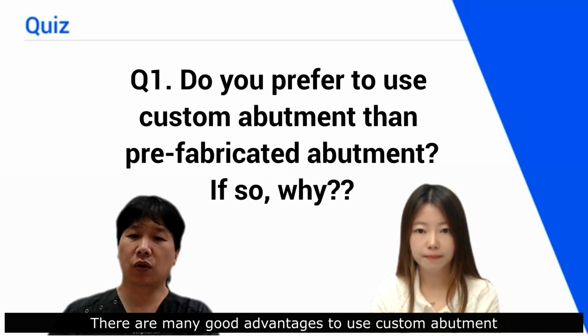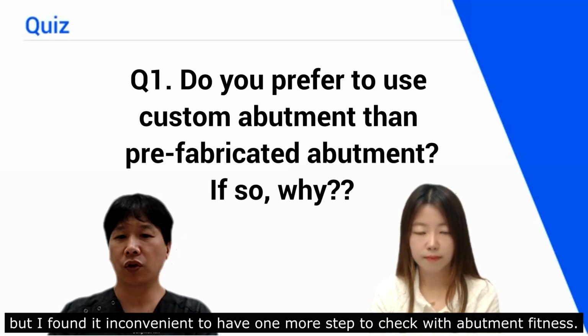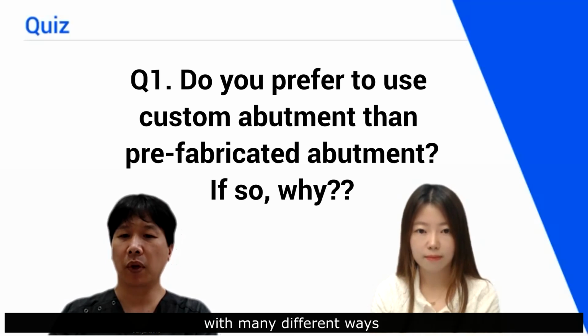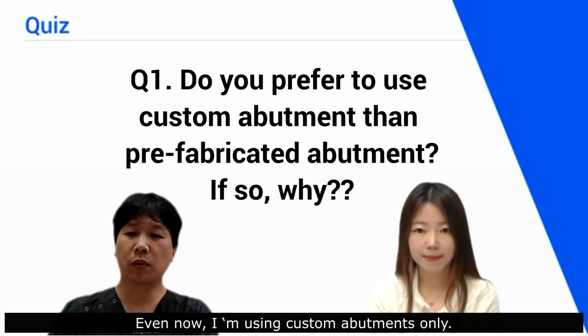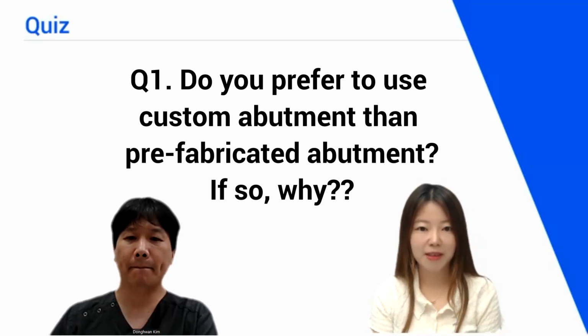There are many good advantages to use a custom abutment, but I found it inconvenient to have one more step to check with abutment fitness. However, I consistently try to overcome the fitness issue with many different ways. I was able to find the solution that I shared in today's lecture. Even now, I'm using custom abutments only. Thank you for answering that.